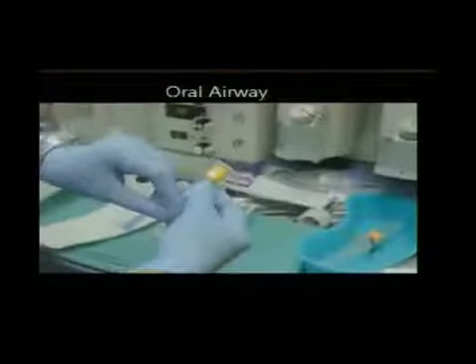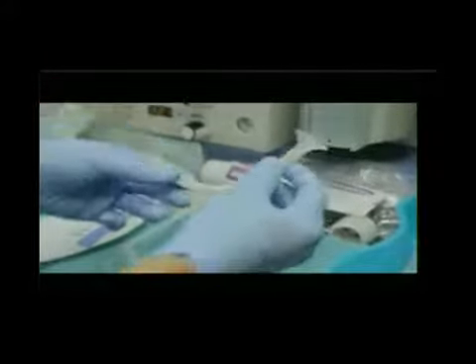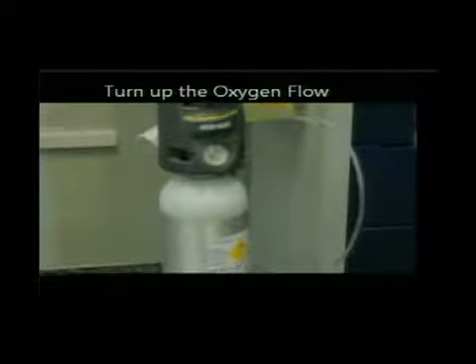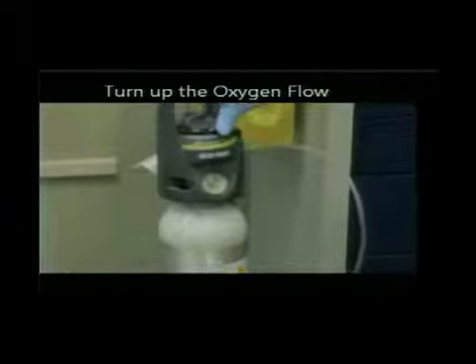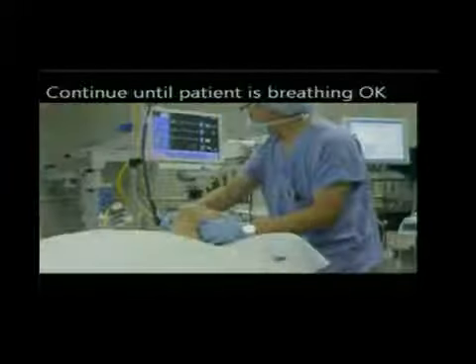Again, this is something that physicians learn in medical school, and it's an expectation that every physician recognizes airway obstruction and knows these simple maneuvers to open an airway. Next. And now you can see the patient is, again, breathing here. If you need to, you can put in this oral airway or this nasal airway. If those fail, then you put in something to move the tongue out of the way, and you turn up the oxygen so the patient is receiving additional oxygen as well.